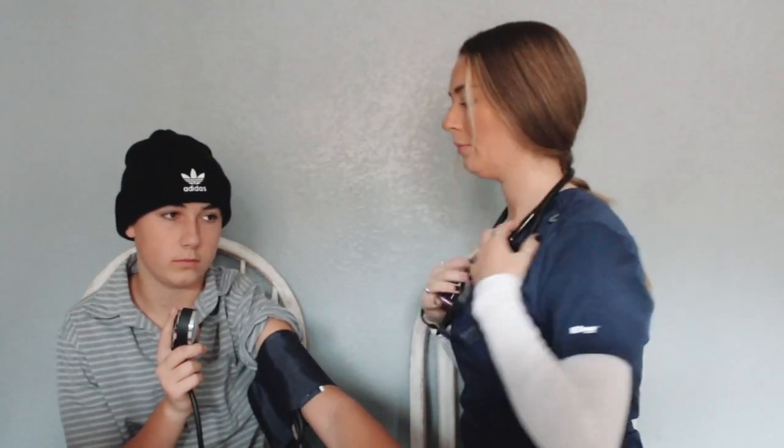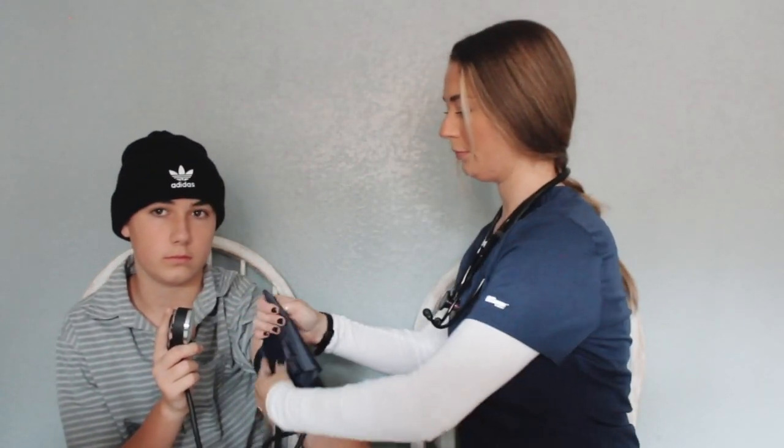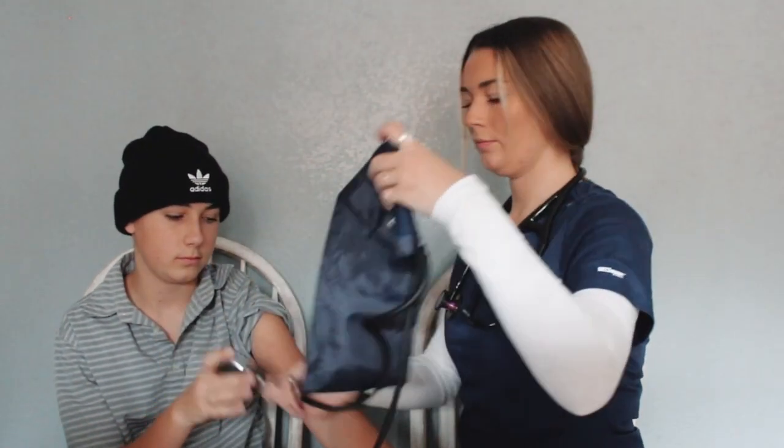The first beat I heard on Mason was 116, and the last beat was 72. Therefore, his blood pressure is 116 over 72. It takes immense practice being able to hear the first and the last heartbeat, and maneuvering the valve slowly in a timely manner.